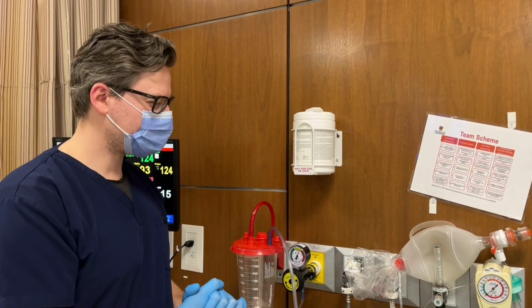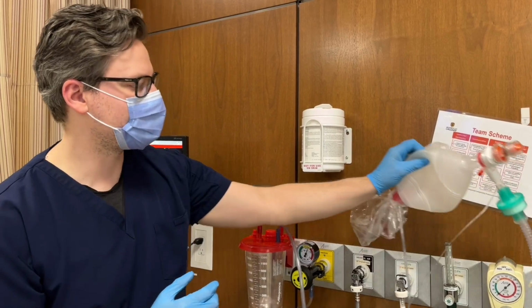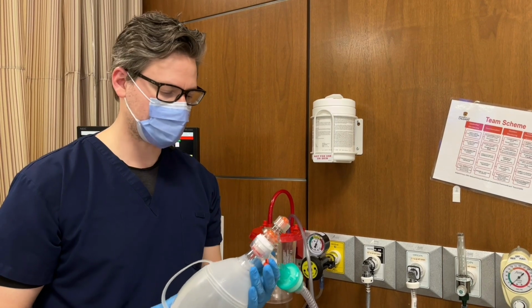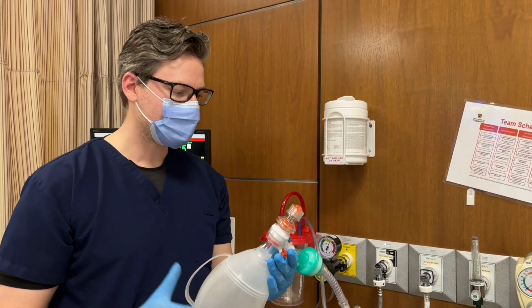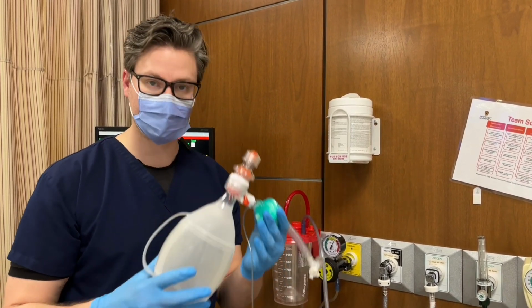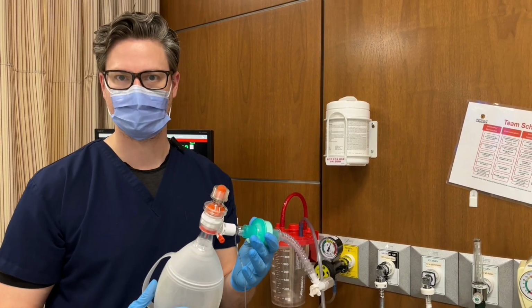The other aspect of the non-patient assessment is to check our manual resuscitator. Manual resuscitator is used to manually ventilate or breathe for the patient when they're not on a mechanical ventilator. And that could be to troubleshoot the ventilator or to troubleshoot an issue with the patient themselves. Ensure that you do a full check of your manual resuscitator prior to beginning your assessment with your patient.